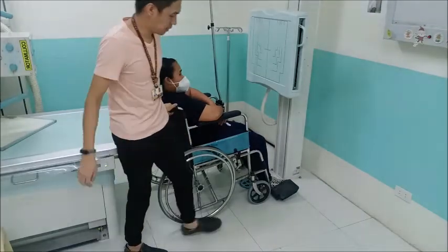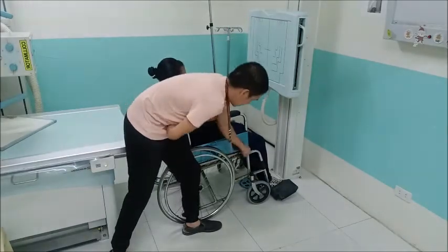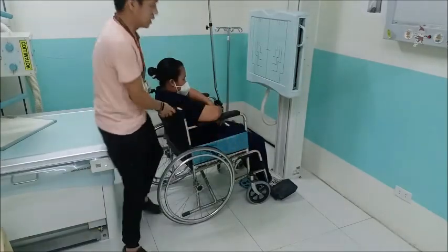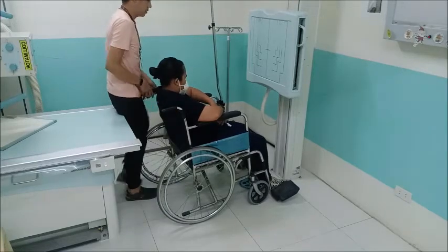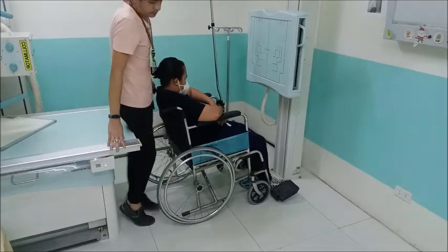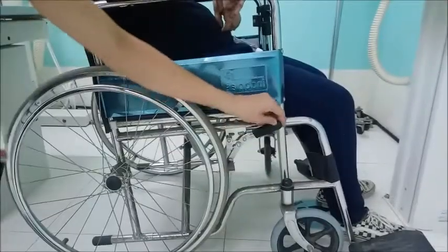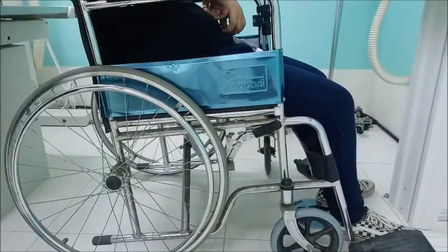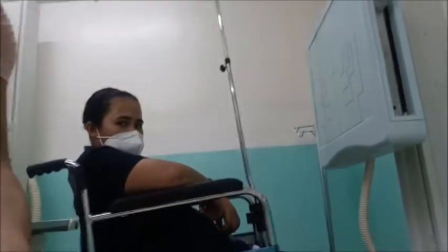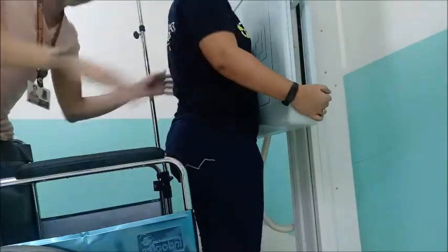So if ipatindog mo sa patient, tatanin mo sa patient nga pwede na siya matindog, pwede na siya mo backlie, ipadungol lang gihapon ang wheelchair. So make sure to lock all the wheels of the wheelchair. You have to lock all the wheels of the wheelchair and then ask the patient to stand if possible. Pwede rin mo tabangan si patient.